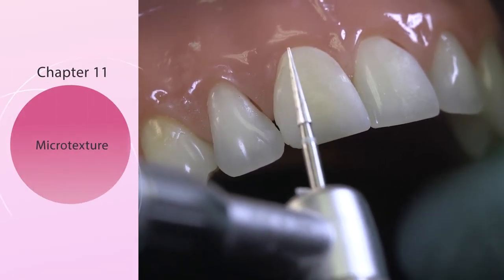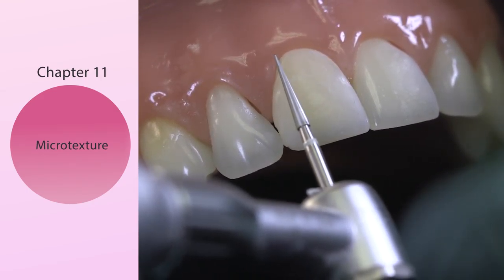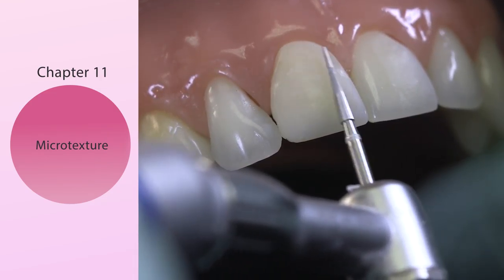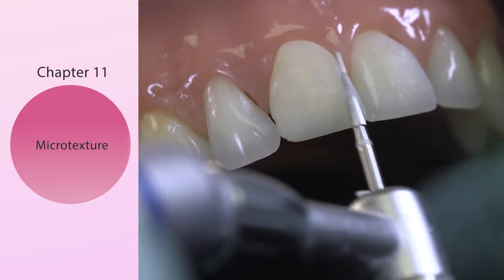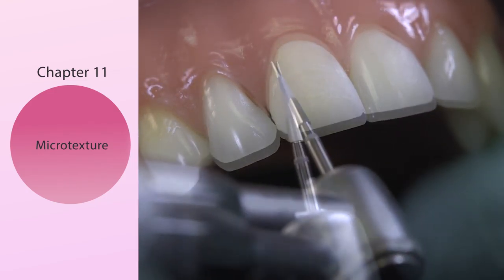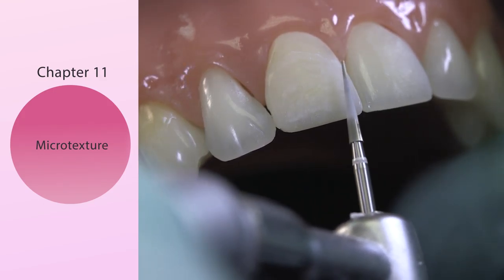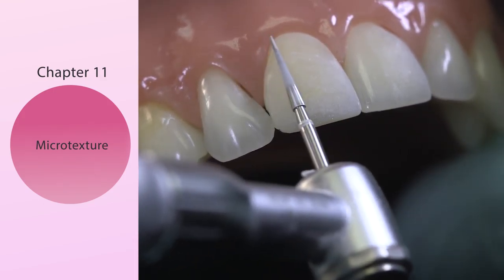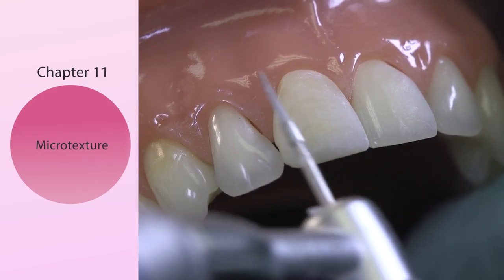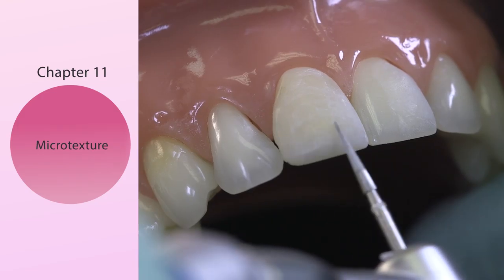How do we create the microtexture? Let's start with the very fine white carbide bur. Just look at the little bit of dust that comes off. What I'm doing is verifying the surface so that I have no irregularities. Every place I go, I want to come right back the same way. You can see the uniform surface that I have — there are no irregularities. What I've just demonstrated with the white carbide bur is that my surface is indeed uniform.